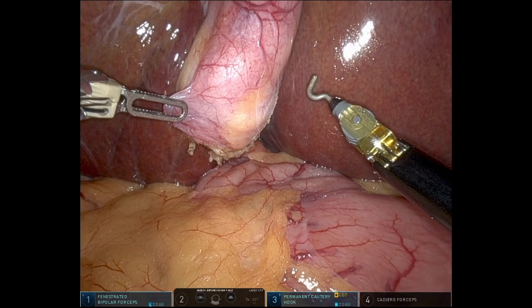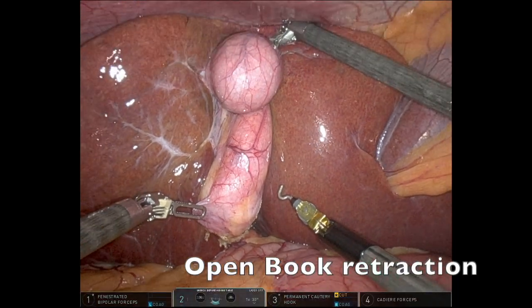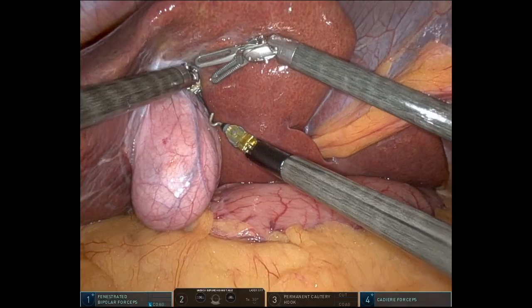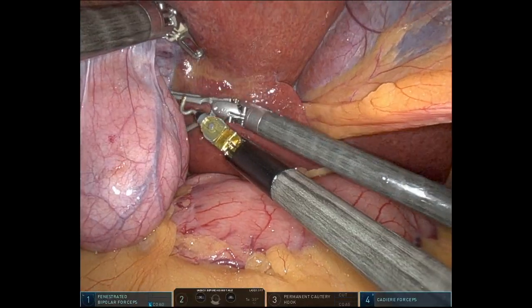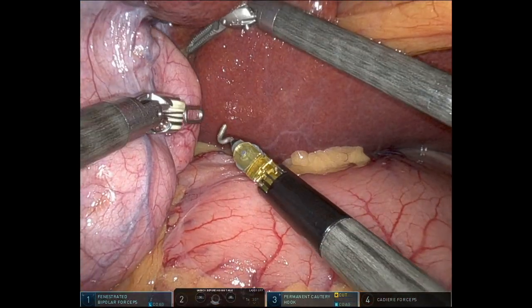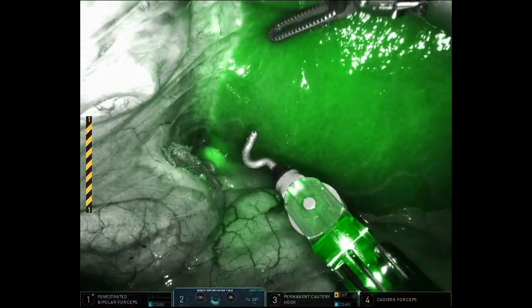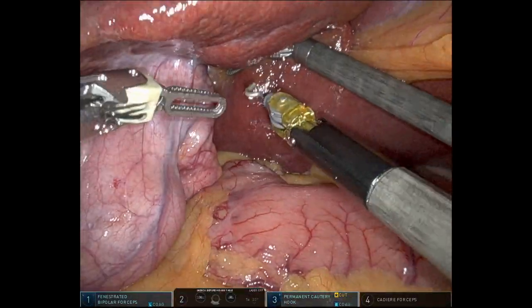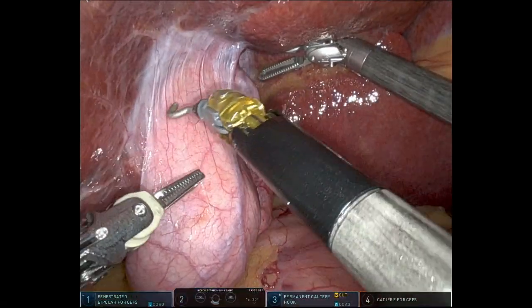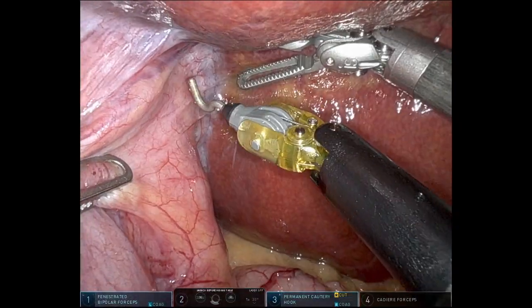So I took over and showed him what I would do with arm four. The way I normally do my open book cholecystectomy is I use arm four to retract the liver, especially with these heavy fatty livers. As you can see, as soon as I retract the liver, I can really see the medial side of the gallbladder well, and this is what's going to make the surgery safer. I'm going to open up the medial peritoneal attachments and then pull the gallbladder even further away to make the surgery even safer.